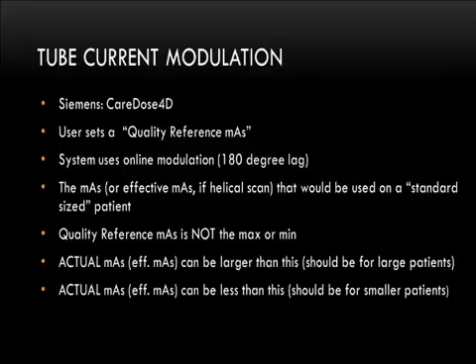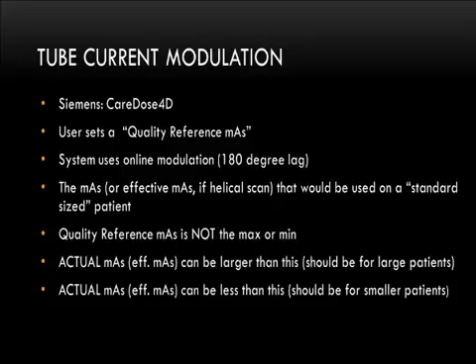That doesn't account for the size of the patient. It's just modulating from the lateral to the AP to predict what's for the next lateral and the PA. I'm going to get it right.